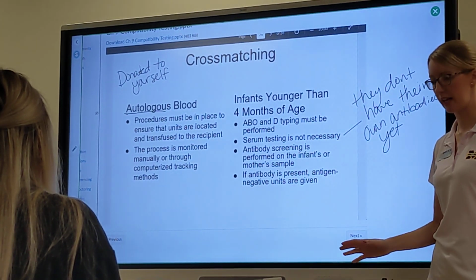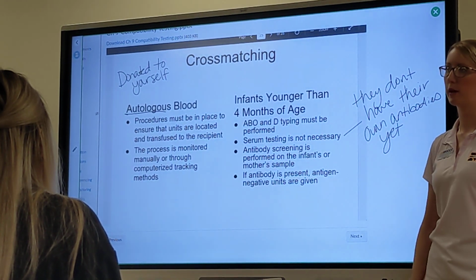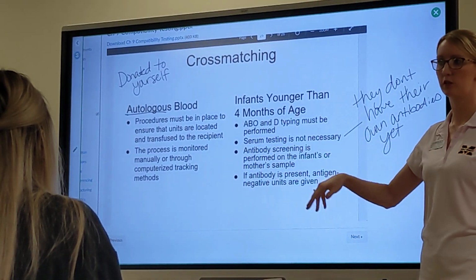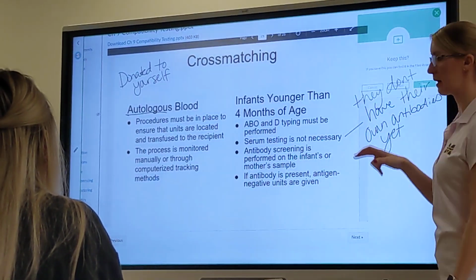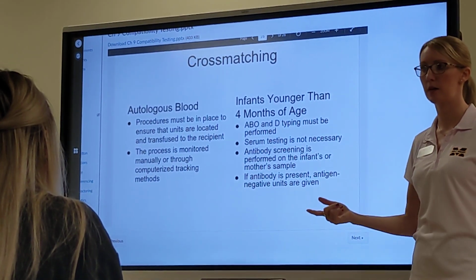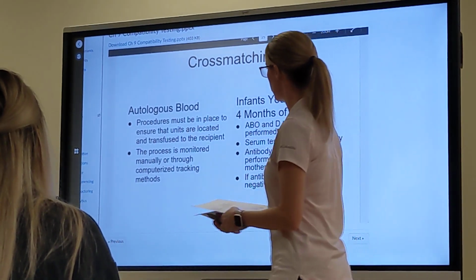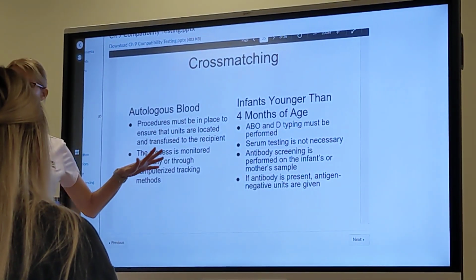And I'm like, wait a minute. I looked at it and I saw the results didn't match, and I was like, how old is this person? And I looked and it was a brand new baby. And I was like, don't look at the reverse. Don't even put that in the computer. It won't even let you put that in the computer. That's your problem. It's got mama's antibodies. The baby had a different blood type than the mama, and it had mama's reverse antibodies in its plasma. It's gonna make your life hard.